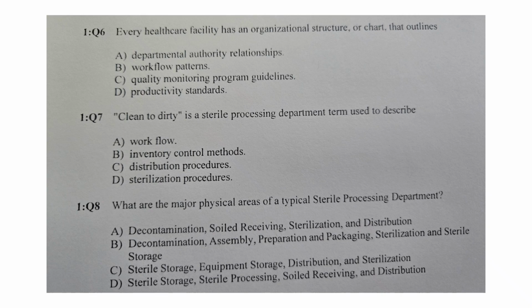Question 7. Clean to dirty is a sterile processing department term used to describe A, workflow, B, inventory control methods, C, distribution procedures, or D, sterilization procedures. The answer is workflow. Clean to dirty is a sterile processing department term used to describe workflow.